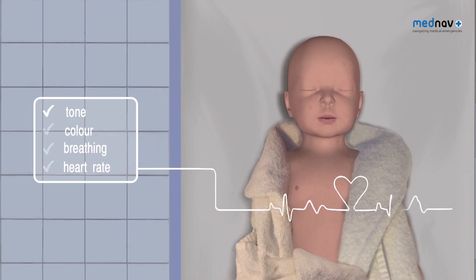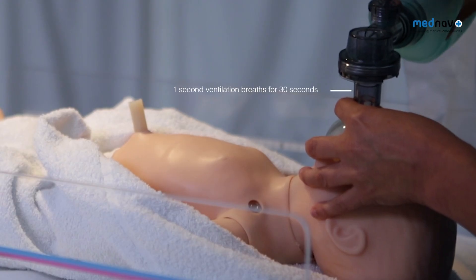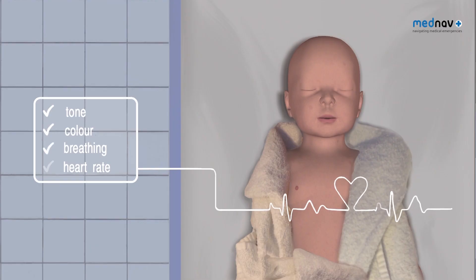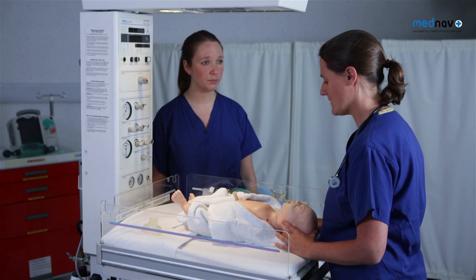If the chest wall has risen, you must go on and assess the baby in terms of tone, colour, breathing and heart rate. If the heart rate is less than 60 and the chest wall is rising, continue ventilation breaths for 30 seconds, then reassess tone, colour, breathing and heart rate.